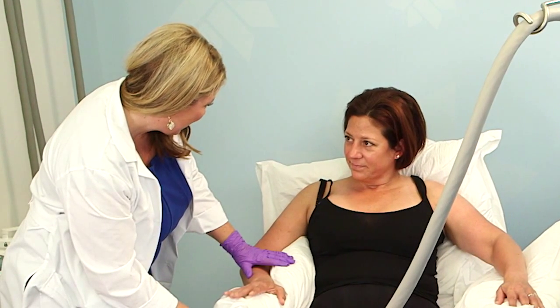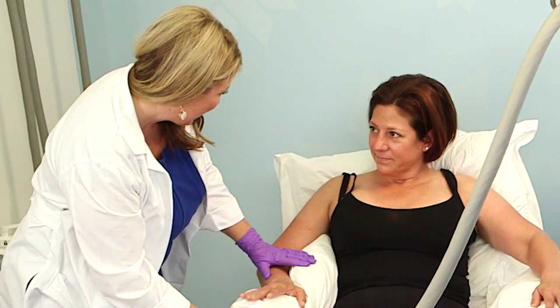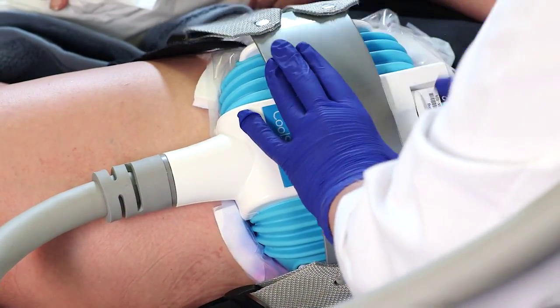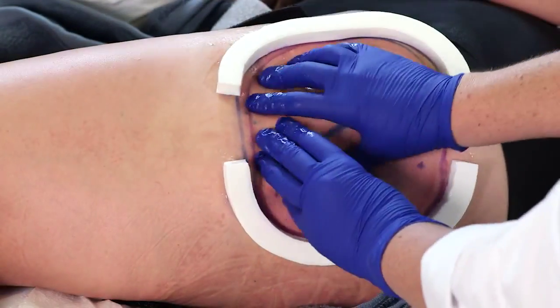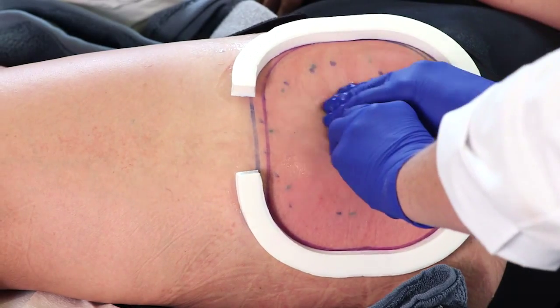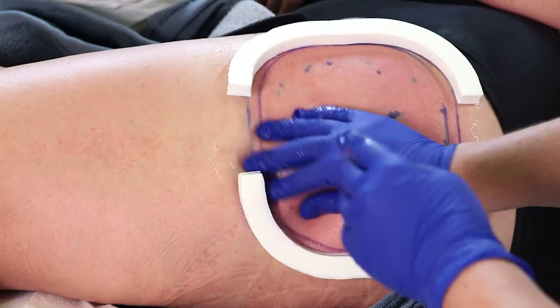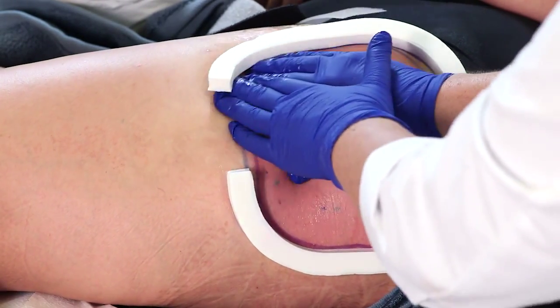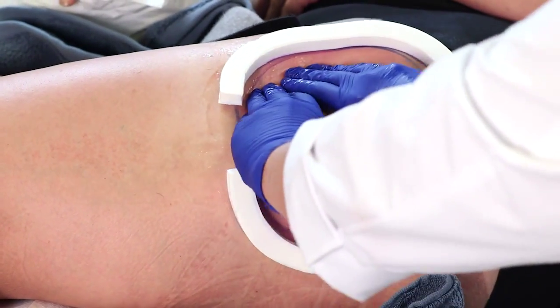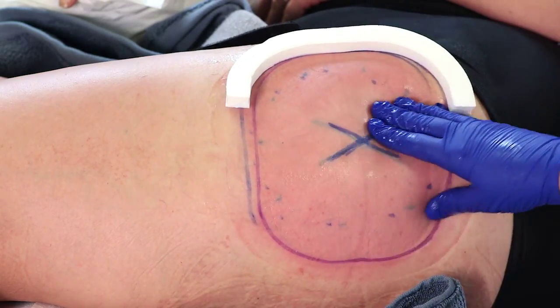Return to the room before the treatment ends and talk to the patient about what to expect during the applicator removal process. After cooling ends, remove the applicator, liner, and single-use gel pad. Begin the post-treatment massage immediately after the treatment ends to manipulate the fat cells when they are at their most crystallized state. In the first minute, vigorously knead the treatment area. While massaging, use the residual gel to gently remove the foam borders. Avoid pulling up on the foam borders as the adhesive will pull the skin.